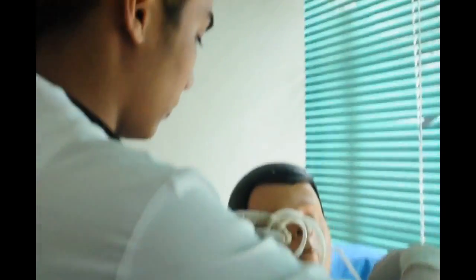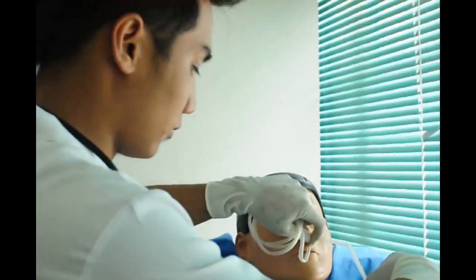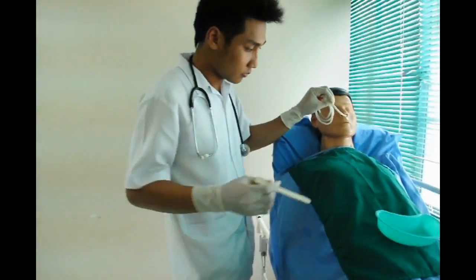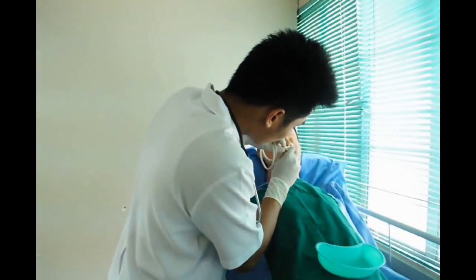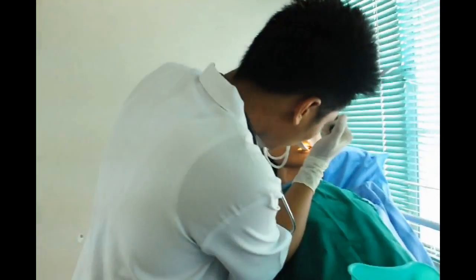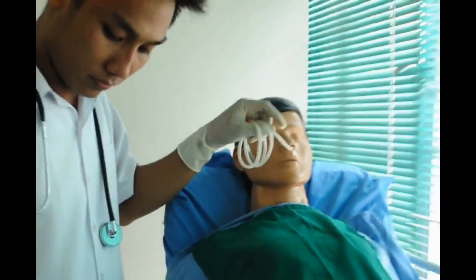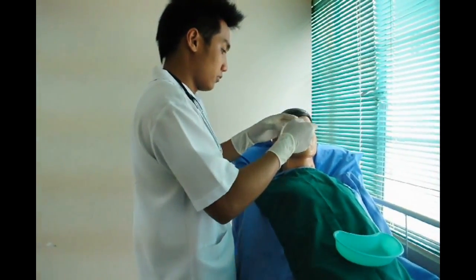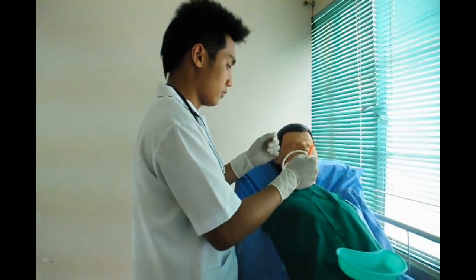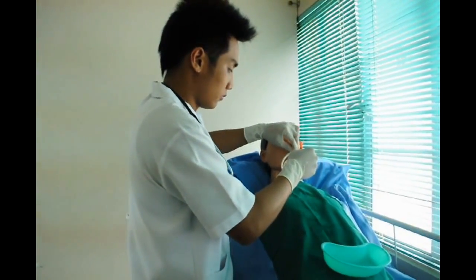Advance as the patient swallows. If gagging and coughing persist, stop advancing the tube and check the placement of the tube with a tongue blade and penlight. Excessive coughing and gagging may occur if the tube has curled in the back of the throat. Discontinue if there are signs of distress such as gasping, coughing, cyanosis, inability to speak or hum. The tube is in the airway if the patient shows signs of distress and cannot speak or hum.